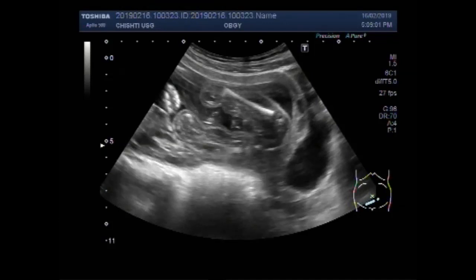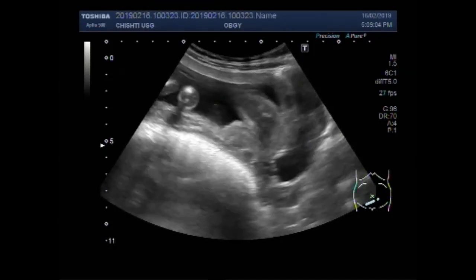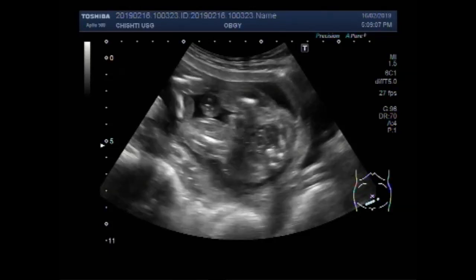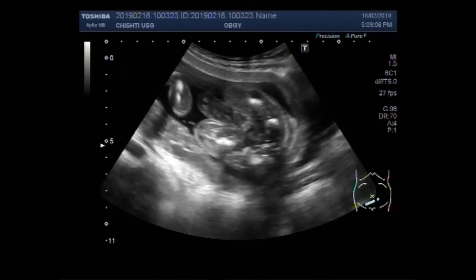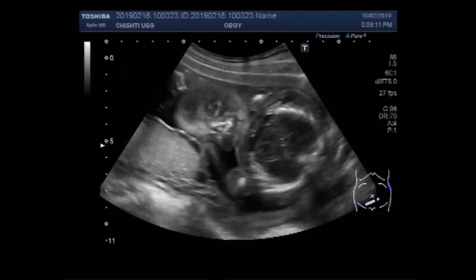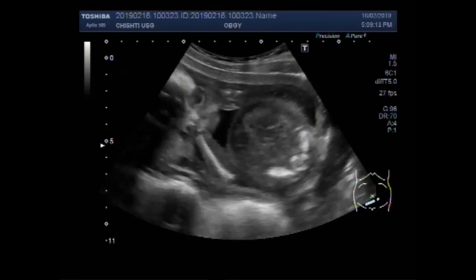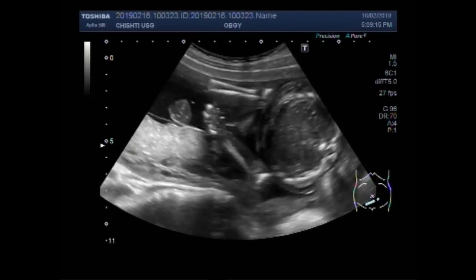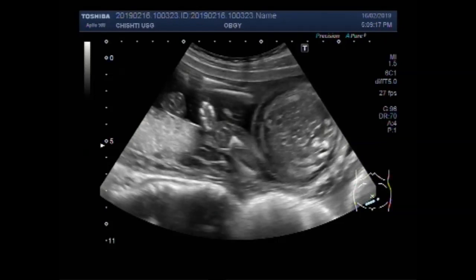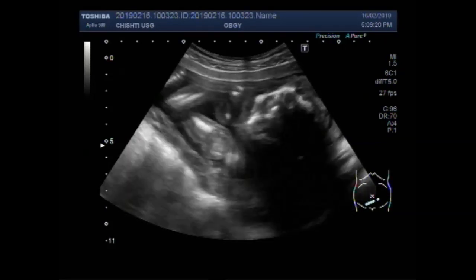The femur of the fetus — the umbilical cord is also visible. No fetal movements are visible.